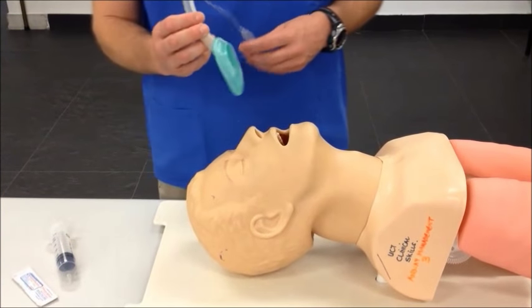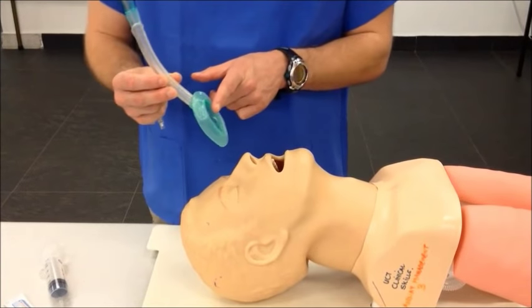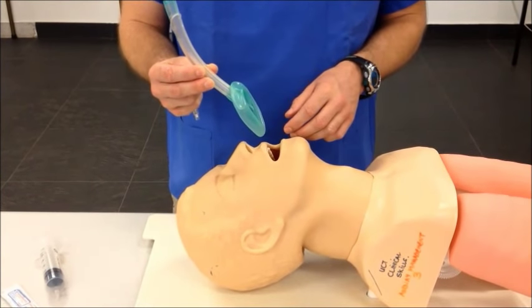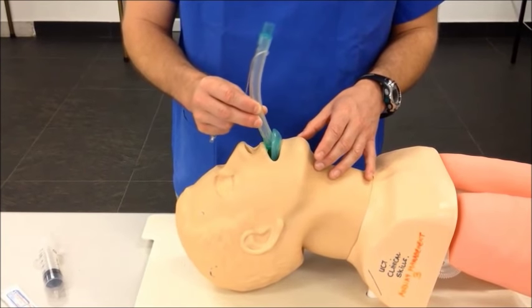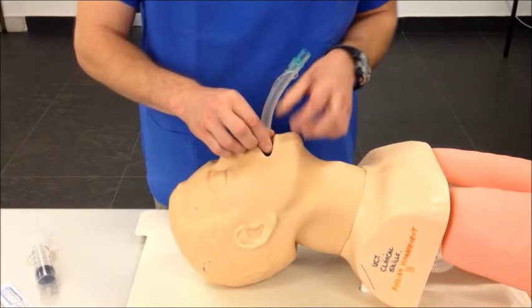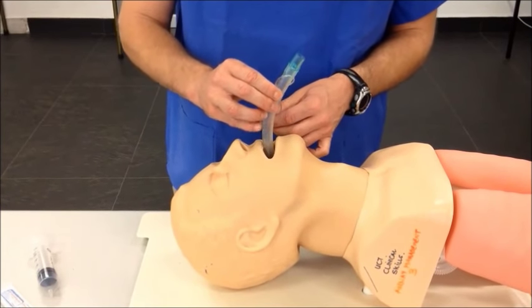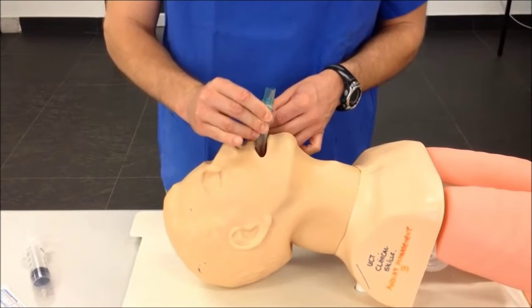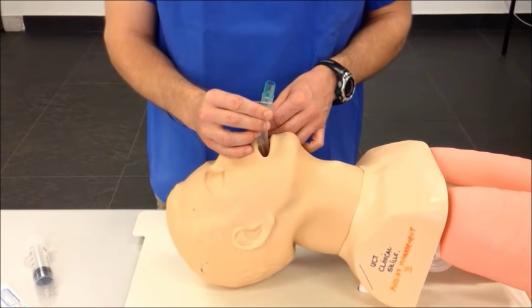To insert the LMA into the patient, make sure the airway part of the LMA points towards the lungs or feet of the patient, and then gently insert into the mouth. It may be necessary to open the jaw. Then with firm but controlled pressure, slide the LMA until you feel it seating in the pharynx and the supraglottic area of the patient.